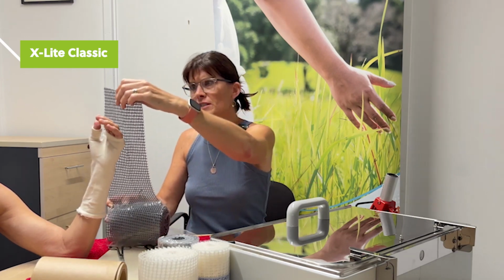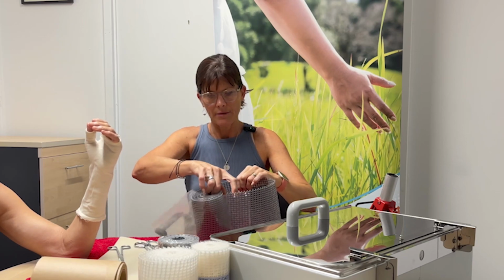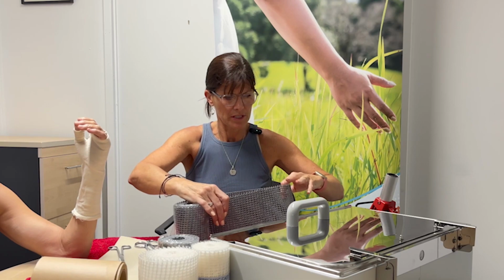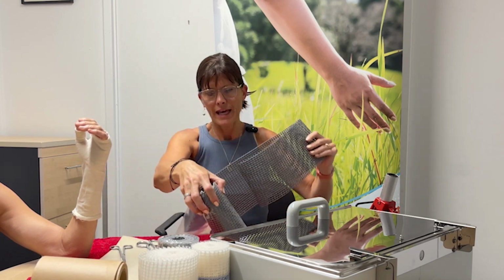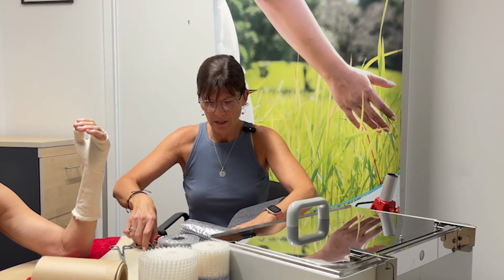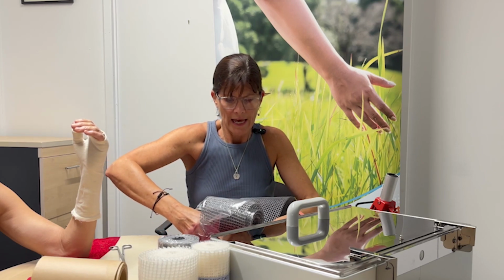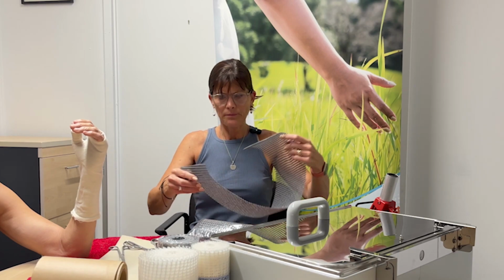First thing I need to do is just measure the length of the material that I need, and I'm going to double that over to give it the increased strength. You could add on a couple of centimeters because it does shrink a wee bit. And you can cut X-Lite with any scissors, don't have to be fancy scissors.